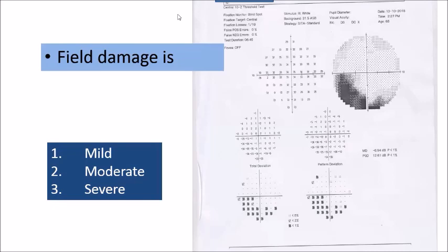This slide or this field is tricky. Most of the people choose to be moderate, but if you look a little bit up, this is the central 10 degrees. It's not 24. That's why you fall in this trick. So all these changes are in the central area. Okay.